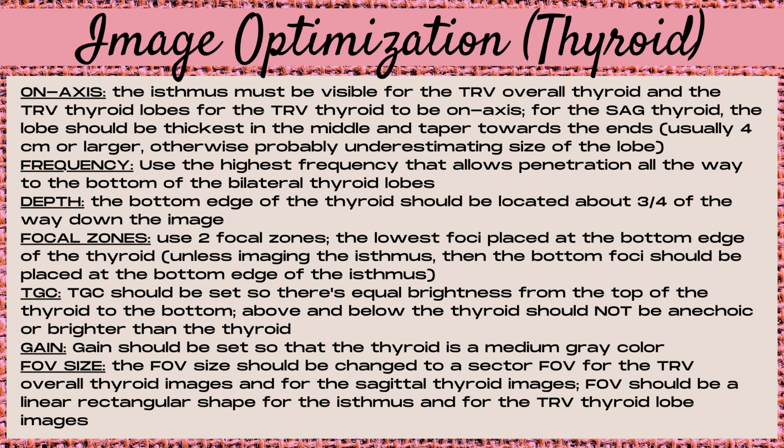For TGC on a thyroid exam, set it so there's equal brightness from the top to the bottom of the thyroid lobe. Pay attention to above and below the thyroid — ensure it's not anechoic and not hyperechoic. Don't make it brighter than the actual thyroid. For gain, set it so the thyroid is a medium gray color. For field of view size, use a sector field of view shape for the transverse overall thyroid image and sagittal thyroid images, and a linear rectangular shape for the isthmus and transverse thyroid lobe images.